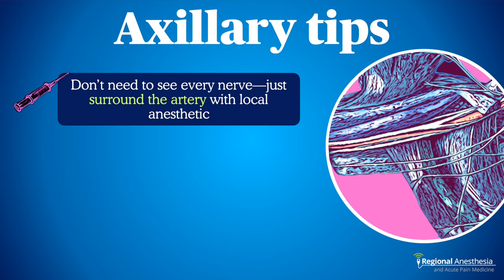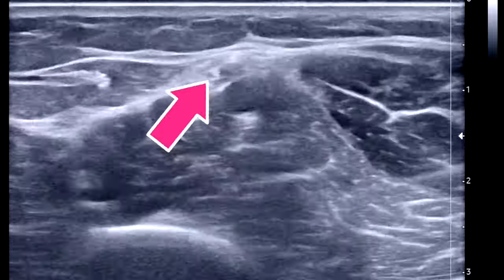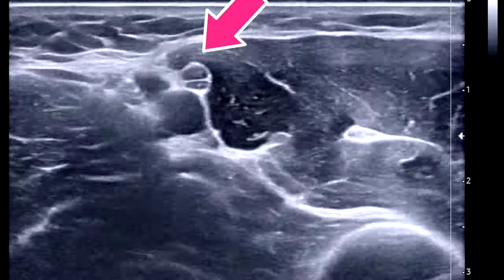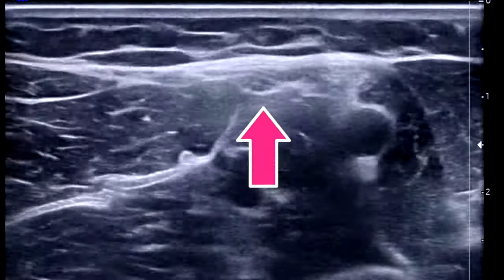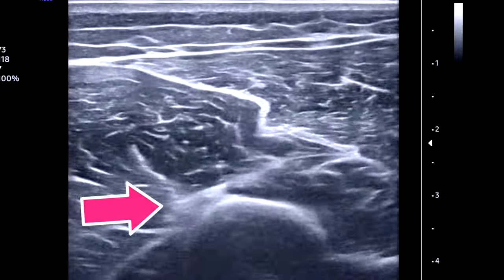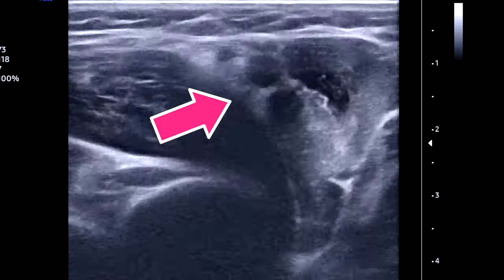Tips: while it's fun to identify each nerve individually, for median, ulnar, and radial a perivascular injection works perfectly — just get sufficient local both above and below the artery. If nerve identification is unclear in the axilla, try tracing the nerves from their predictable locations further distal on the upper arm: the median nerve stays close to the brachial artery up from the antecubital fossa; the ulnar nerve hangs off the brachial fascia from the medial epicondyle; the radial nerve falls into the spiral groove of the humerus and winds posteriorly up to the axillary artery.